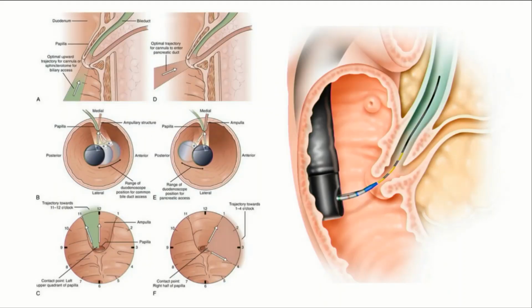So we should not forget that whenever we do an endoscopy, we are not working in 3D mode. We are working in two-dimensional mode. The 3D impression is going to come over time with experience. Only after doing lots of endoscopies, colonoscopies and ERCP, you're going to have the 3D vision inside your eyes, although you are working with two dimensions.